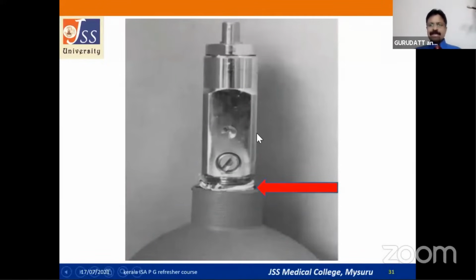But in the exam, if you are asked to show the safety relief device, the pressure relief device, you try to look for it just below the conical depression. It is not there in Indian cylinders. Then you can be asked, what precaution or method of safety is adopted in our Indian cylinders?